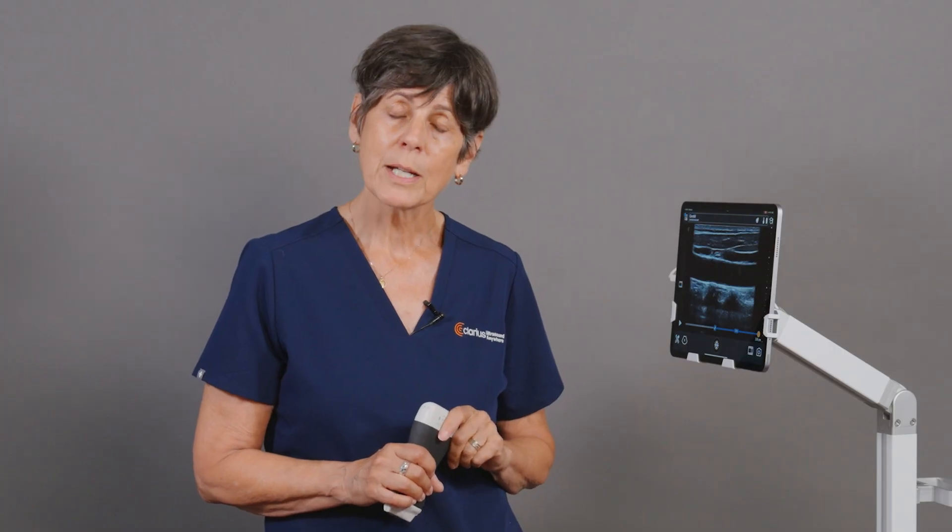The volume flow calculation requires two measurements. The first is the diameter of the vessel, and the second is using pulse wave Doppler, where you obtain a trace of the Doppler spectrum and get time averaged velocity information, or TAV.